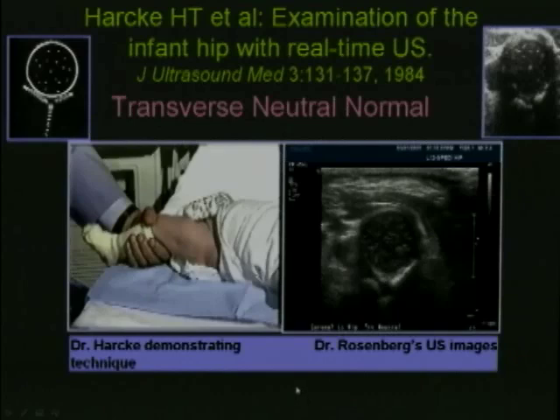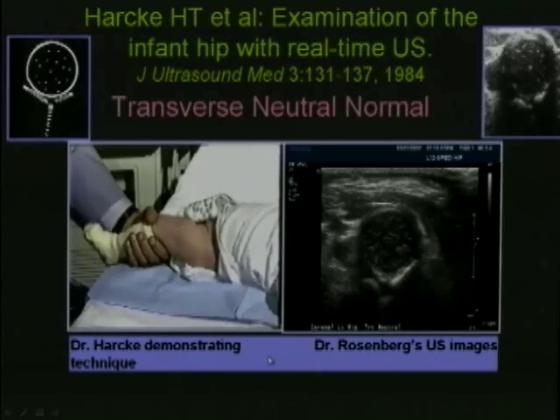Now I'm going to show you some video clips. And actually, the clips that you see of the person scanning are the hands of Dr. Harkey, and he was kind enough to allow me to get AVI clips made from a video that he made a long time ago when he first started teaching people how to do dynamic hip sonography.